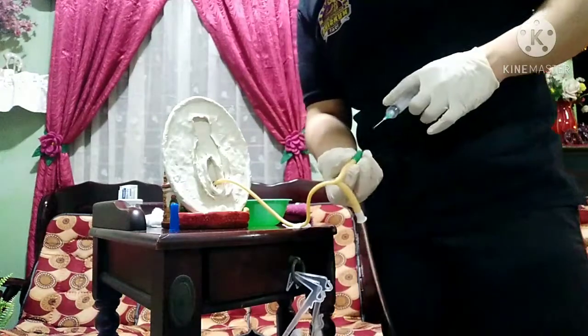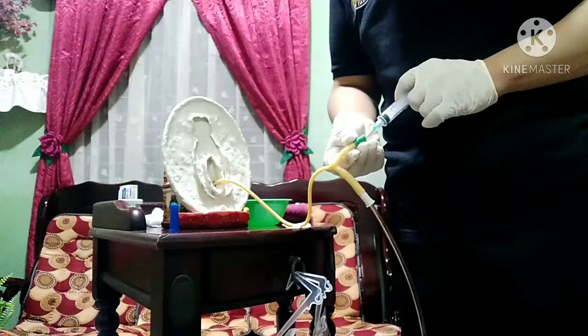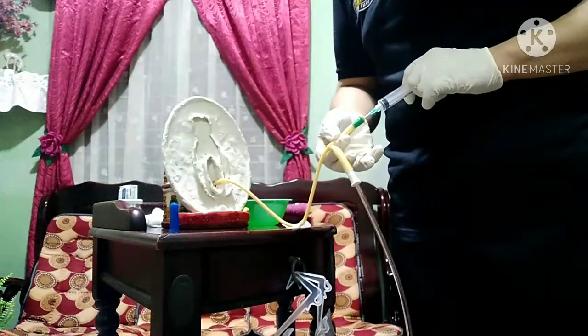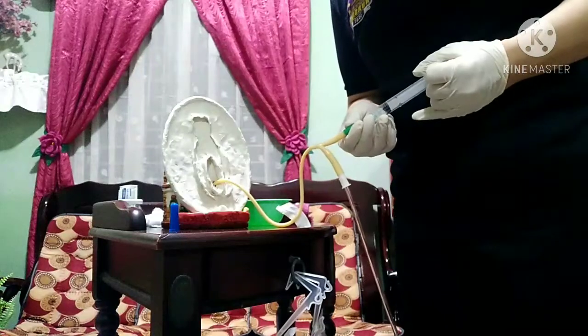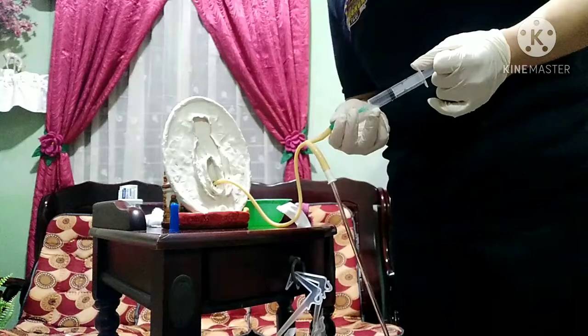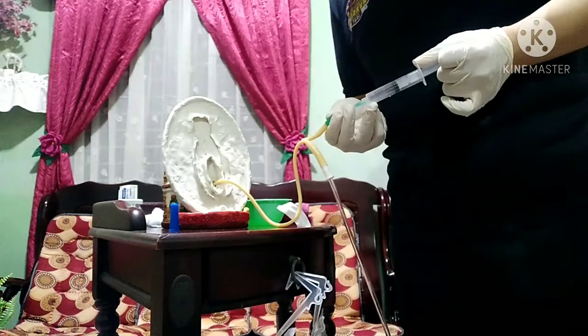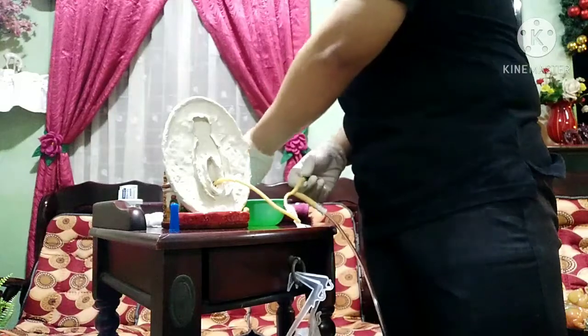So, makikita nyo, aalisin na po natin. So, ayun po.